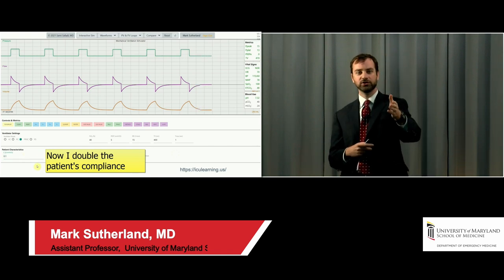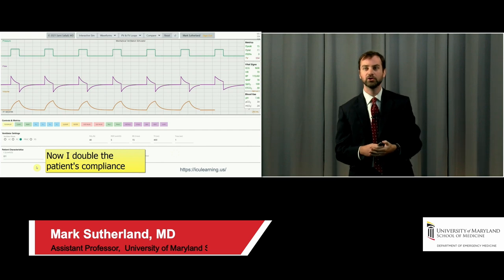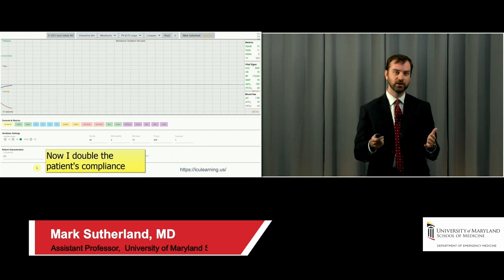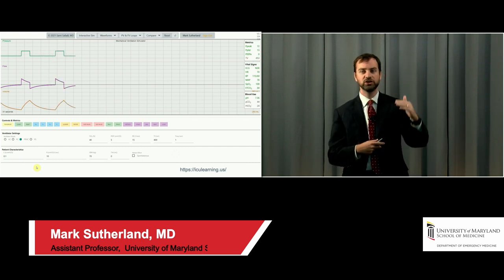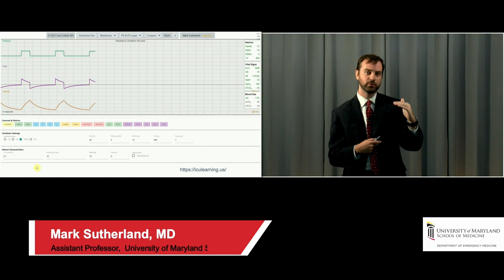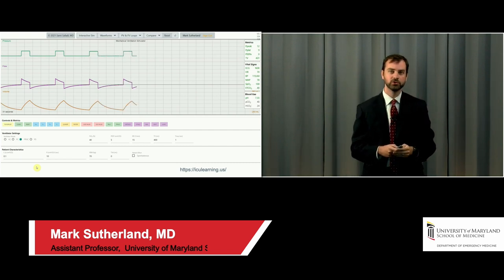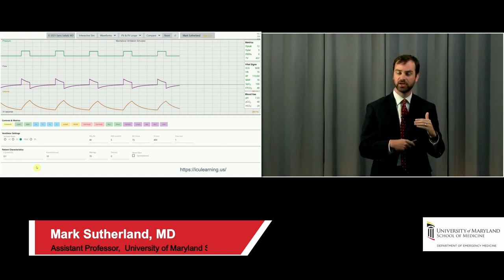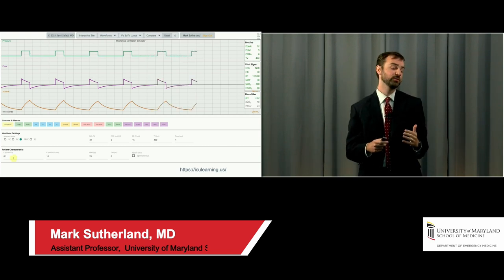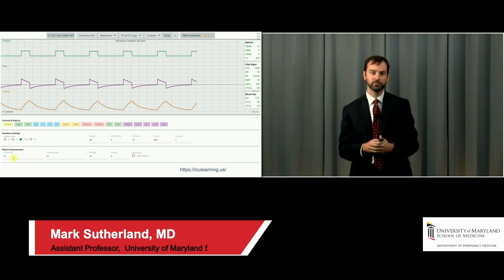Now what I do in the video is I increase the patient's compliance. So I'm going to double the patient's compliance. You'll see we'll get higher tidal volumes than we desire because, of course, delta V over delta P is compliance. And so we're going to get increased tidal volumes. The machine's going to continue to ratchet down that pressure to try and target the tidal volume I'm trying to hit. So again, the machine is using the information it's getting back about tidal volume, which tells it the patient's compliance, to try and hit the tidal volume I want using a pressure breath.